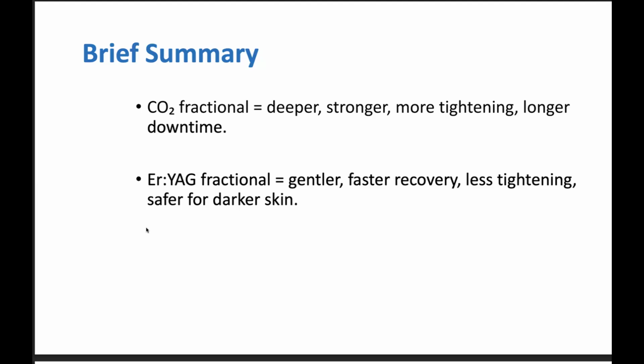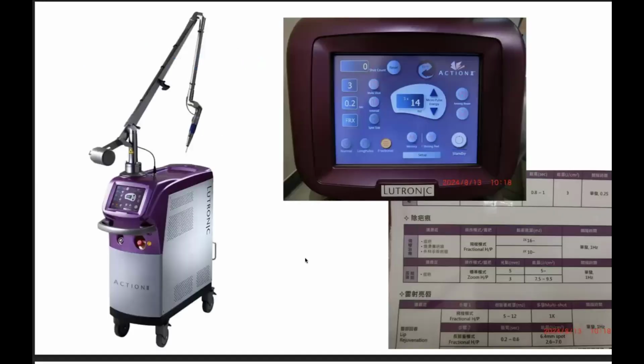Next slide. This is the Erbium YAG laser in fractional mode in my hospital. So I use this fractional laser with the wavelength of 2,940 nanometer, and I can set the energy with a reference from the slide.